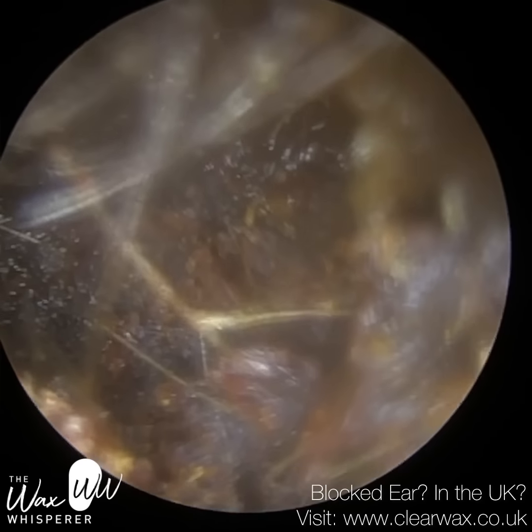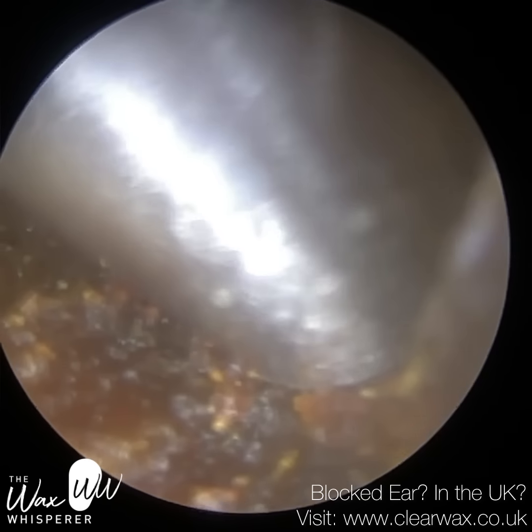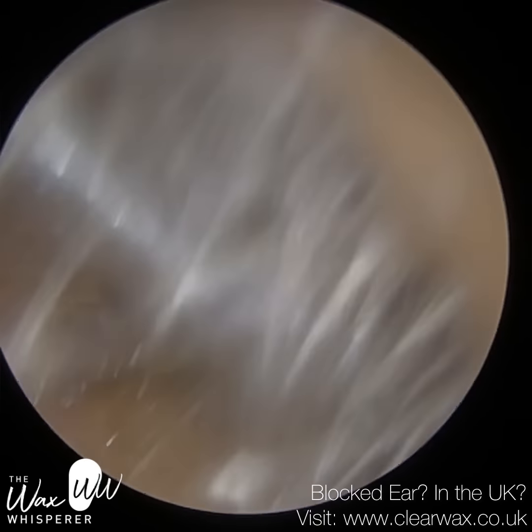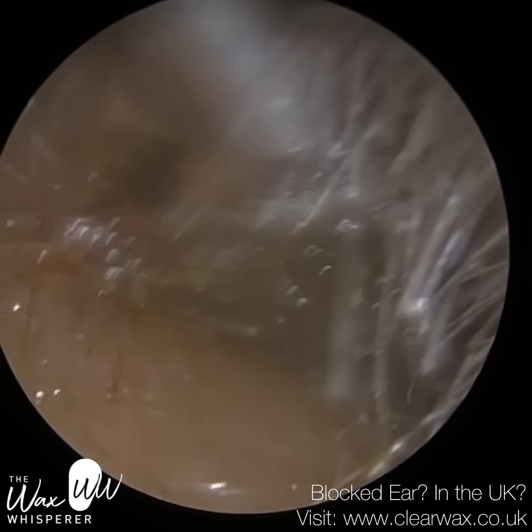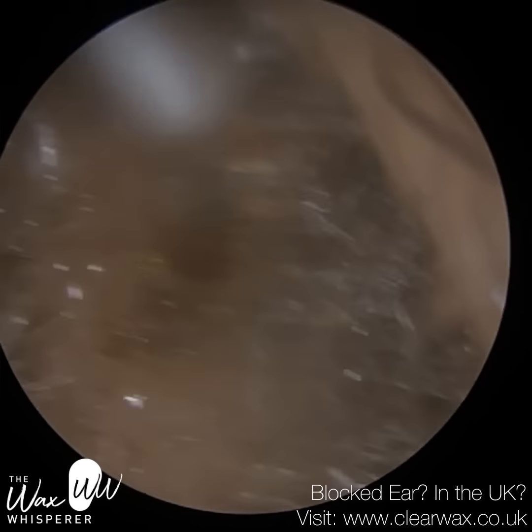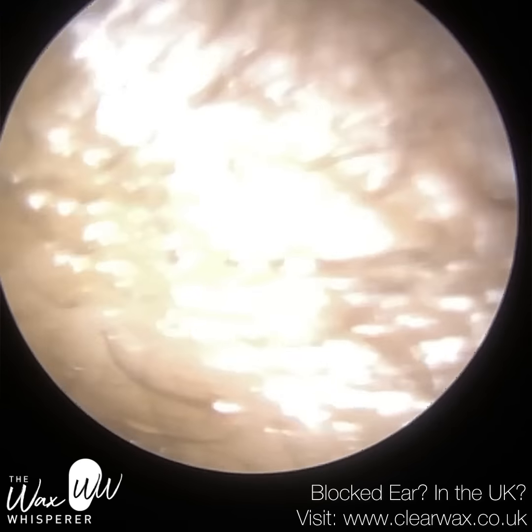At the bottom it's just smeared it slightly, but eventually I do remove it with the curette and it does come out in a big piece. I'm just going to lift this off the floor of the ear canal because it has smeared slightly. When you've got a consistency of wax like this and you're using a curette, it's almost like spreading it — like when you apply jam on your toast. Sorry if anyone's watching this whilst having their breakfast.